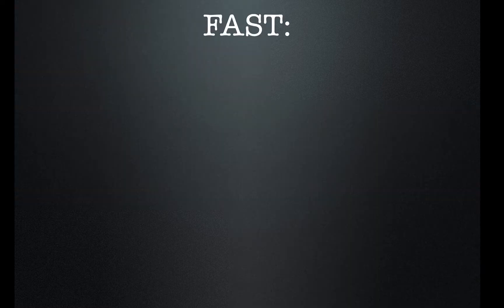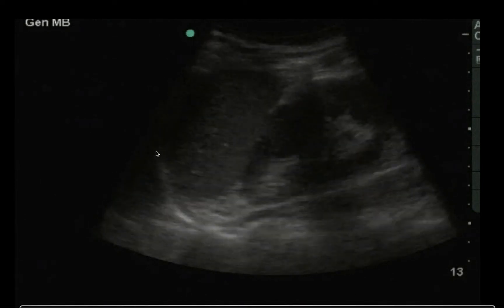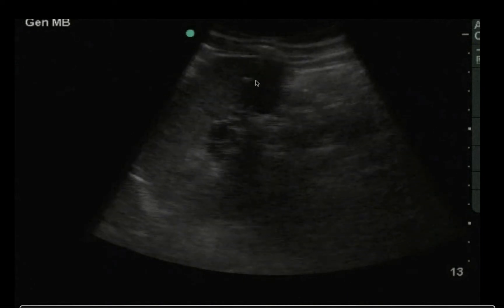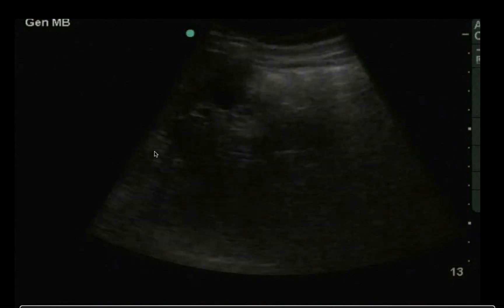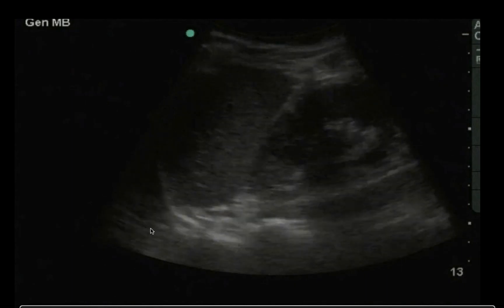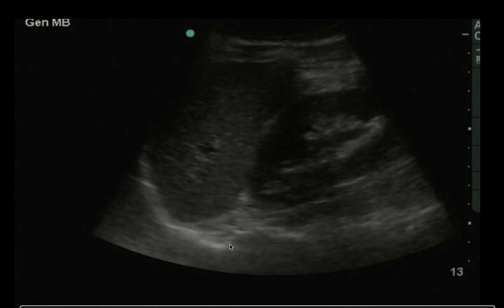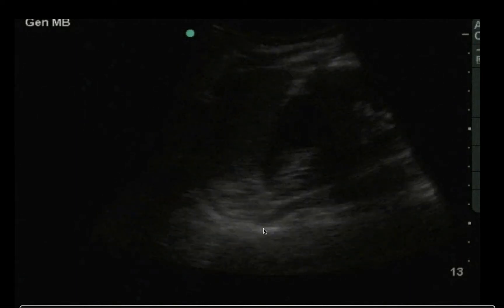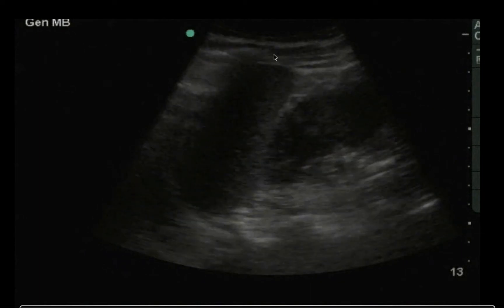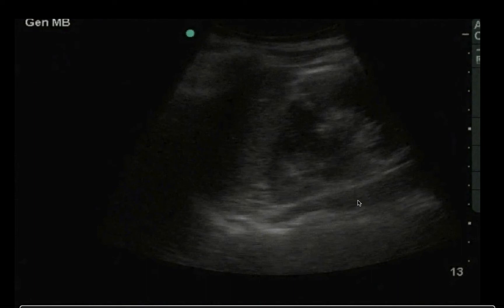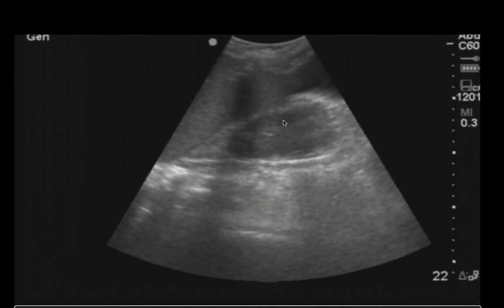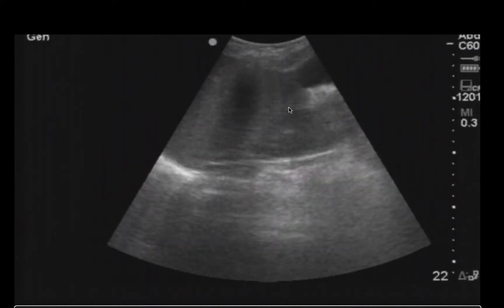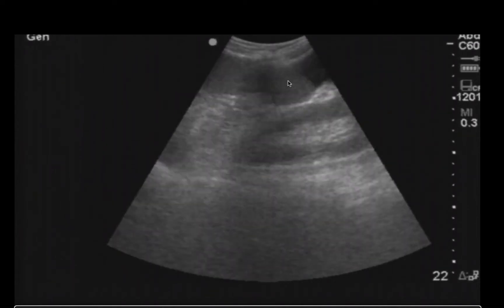Onto the abdominal views of the FAST. Here is a spleen, diaphragm, spine, and kidney. The spinal stripe disappears right at the edge of the diaphragm. This is a negative ultrasound view — no fluid around the spleen, no fluid up in the chest. Next: spleen, kidney, spinal stripe — positive or negative for free fluid? This is positive. There's a pocket of fluid at the distal tip of the spleen in the pericolic gutter.